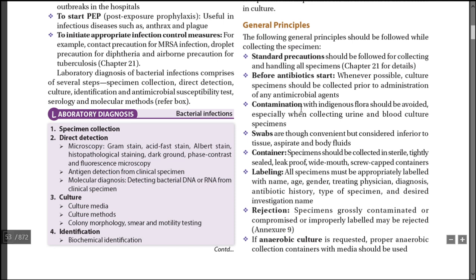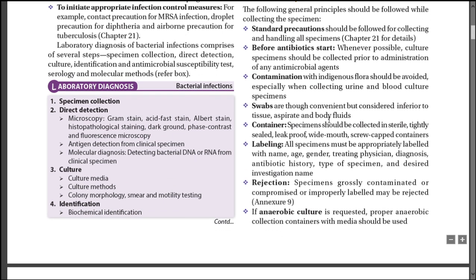Contamination should be avoided. Contamination from indigenous flora should be avoided, especially while collecting urine and blood culture specimens. Swabs are also convenient. Cotton swabs are also convenient, but they are considered inferior to tissue and body fluids.